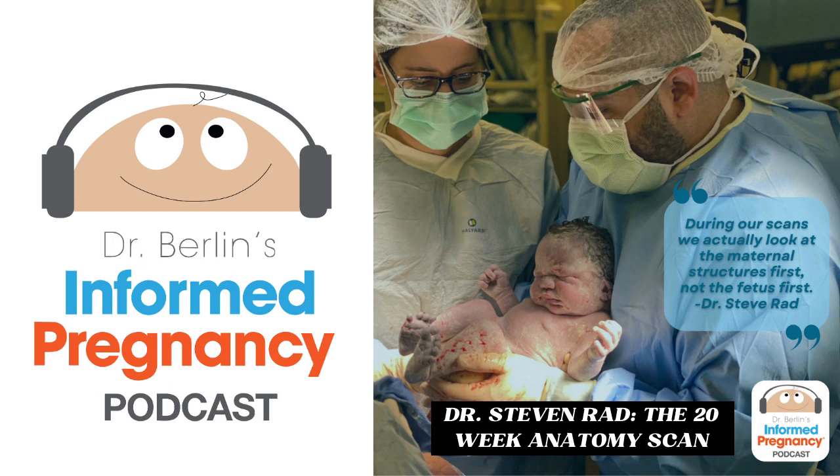We have to have you go empty your bladder and hope the baby flips. So really, it doesn't matter for us. We start whatever. I mean, we have everyone empty their bladder, and whatever we see, we move forward. Like I said, we have an order that we go in, but if the baby's position is not ideal to see in that exact order, we come back to that structure or that organ system.